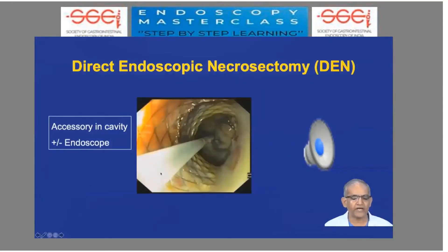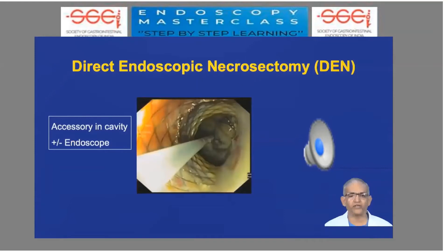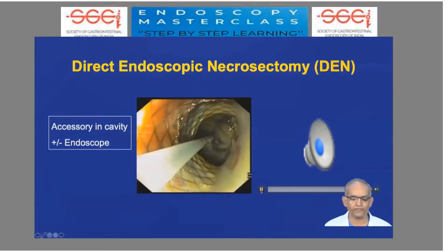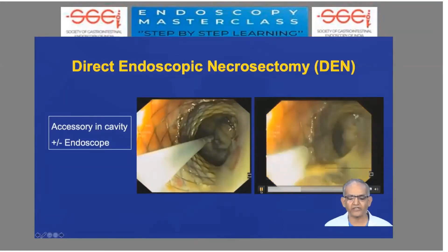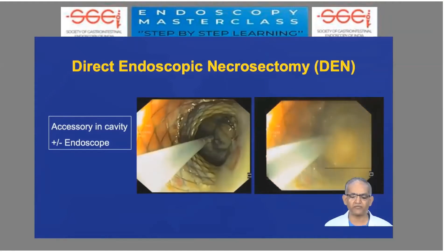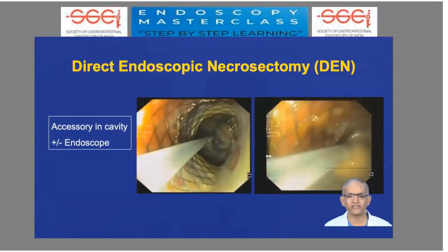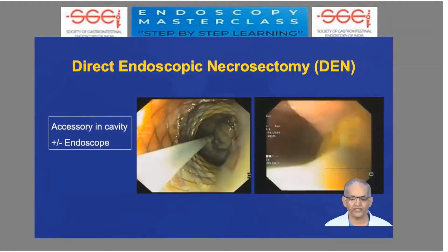For direct endoscopic necrosectomy, the accessory is passed inside the cavity with or without the scope — either the accessory goes in alone, or the scope with the accessory goes inside the cavity. As seen here in this panel, you can see pus coming out and debris inside, but the scope is still outside or just at the mouth of the stent. By visualizing the debris, we can still pull it out.